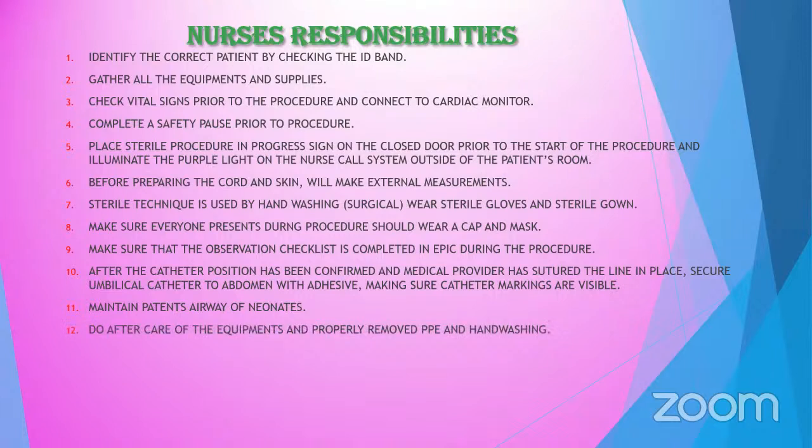And then do aftercare of the equipment and properly remove PPE and wash hands. After the procedure, we need to check that all the equipment is complete, and then we should properly dispose and remove PPE, like doffing. For doffing, we should remove first the gloves, and then the cap, and then the gown, and last is the mask.